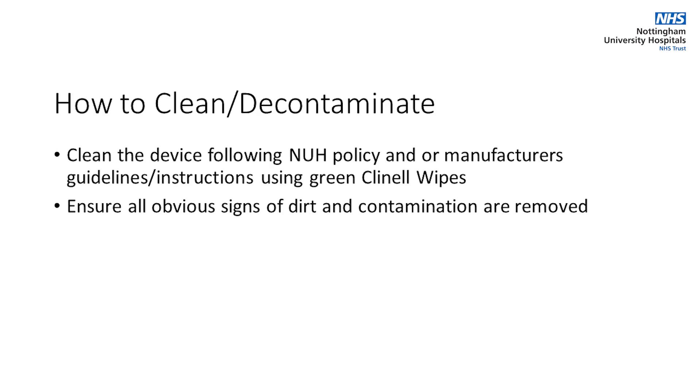Clean the device following the NUH policy and manufacturer's guidelines instructions using green clinel wipes. Ensure all obvious signs of dirt and contamination are removed.